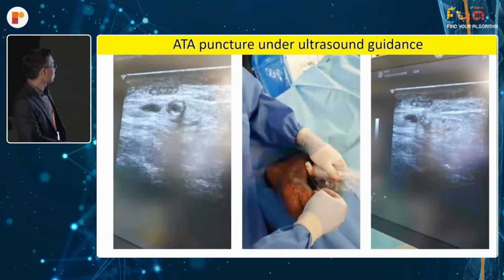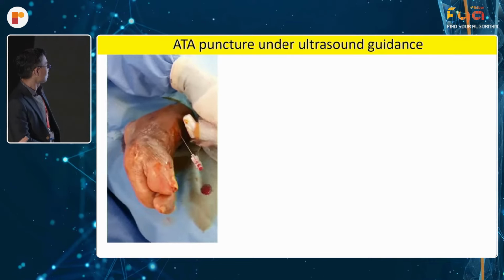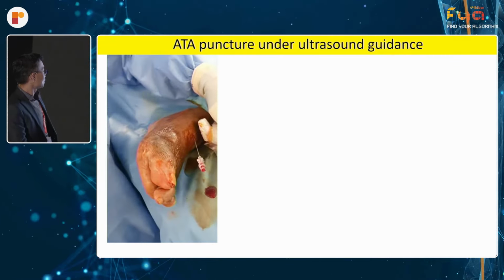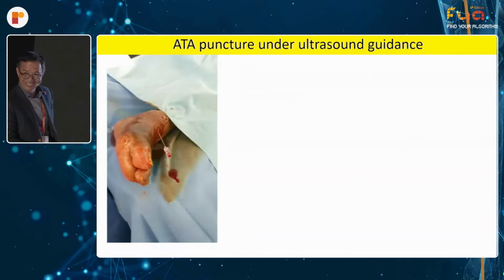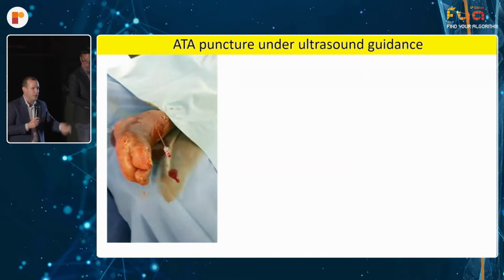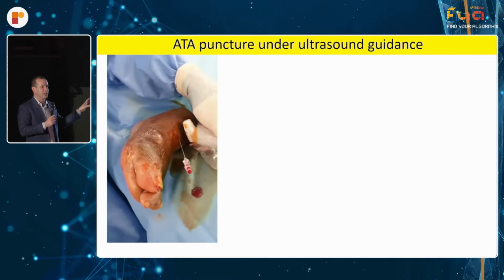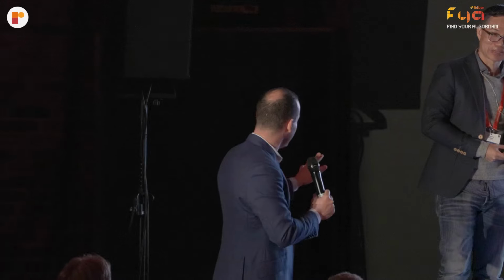If you don't have this bleeding, back bleeding, forget about being inside the artery, okay? So I don't want to see anyone puncturing and then trying to advance the wire. That's the worst you can do. So even in this extremely small, diseased vessel, there's always a back bleeding like this. If you don't have this, forget about advancing a wire. Do we all agree? Green flag if you agree.